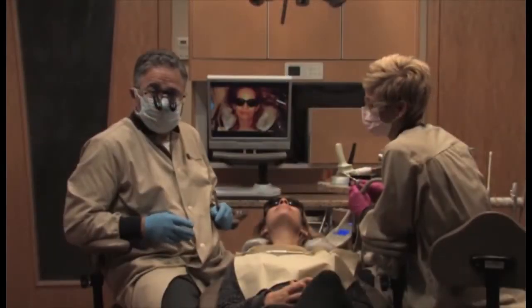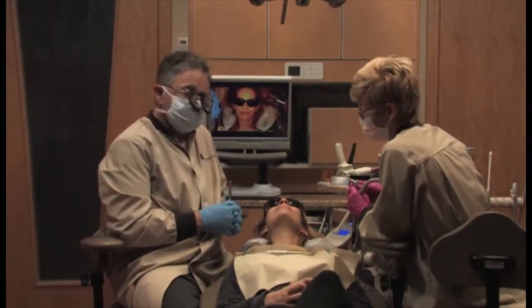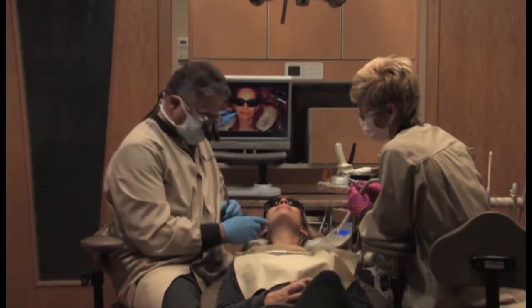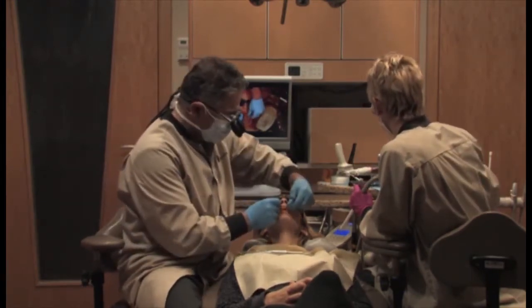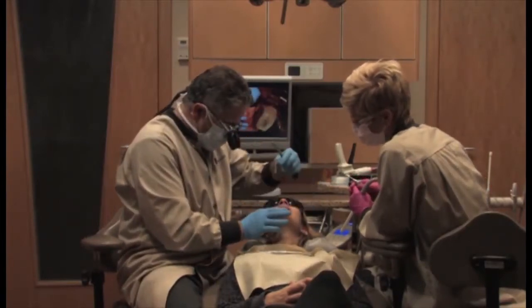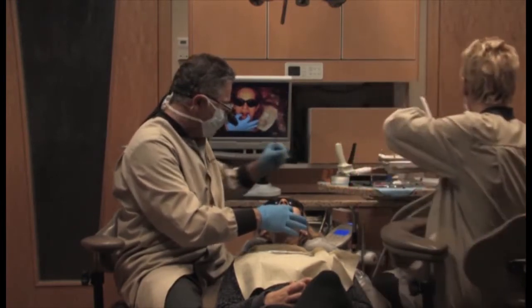If you remember from our trial equilibration, the initial point of contact was on the right side. It was the second molar on the right side that was in occlusion. We should be able to find the same thing as we continue to close down the deprogrammer. I'm going to take it out again. Don't put your teeth together. Kate, let's put cotton rolls between the teeth.